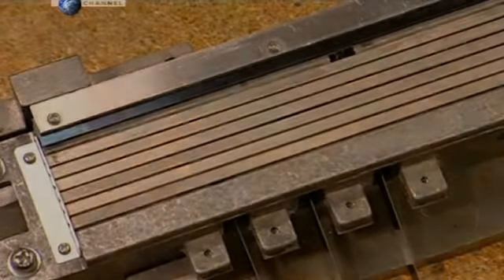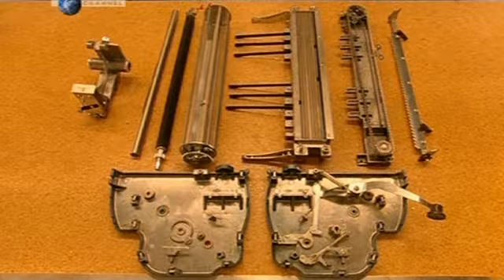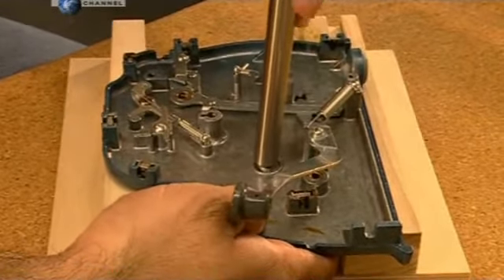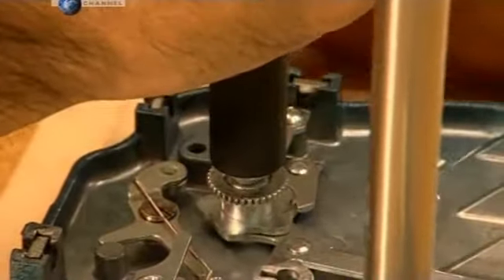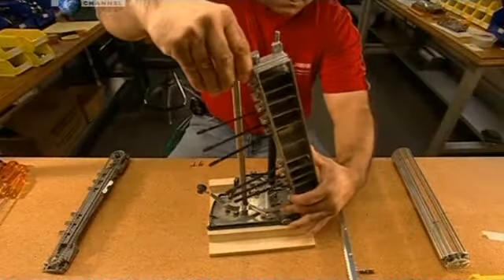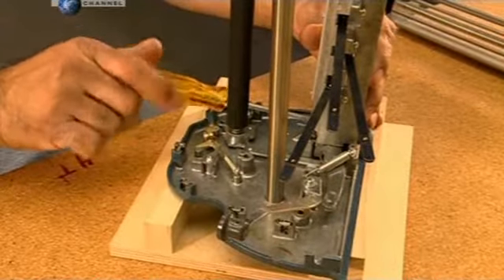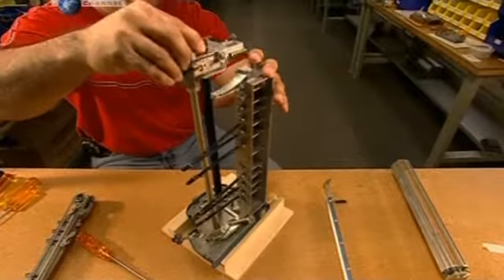The Braille writer's other components are made of cast aluminium. The left end plate covers the left side of the machine, so that the carriage tube is connected. This is the cylinder on which the carriage rides. And then the feed roller, the mechanism which is turned to feed a sheet of paper into the typewriter. Next comes the rear support, that assembly of cam rods and links.